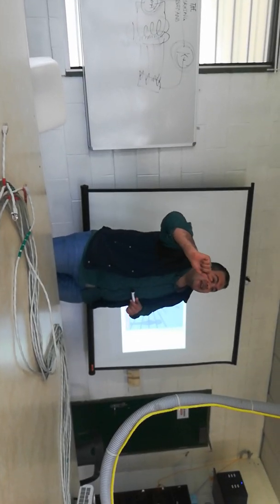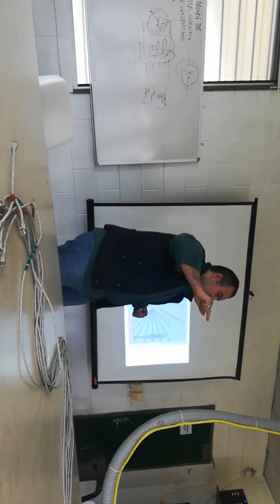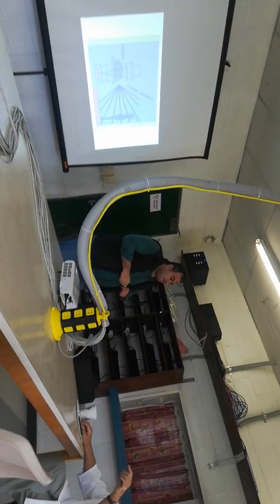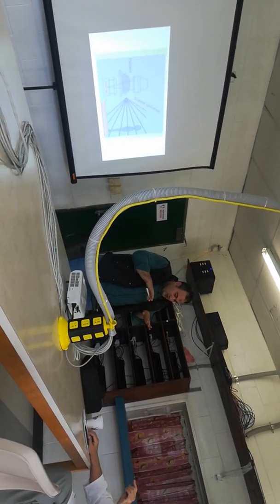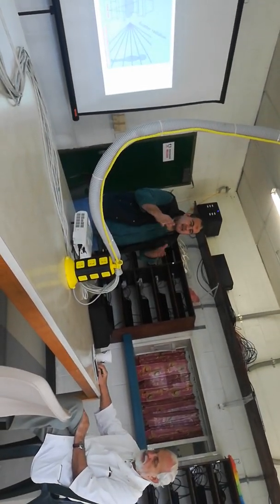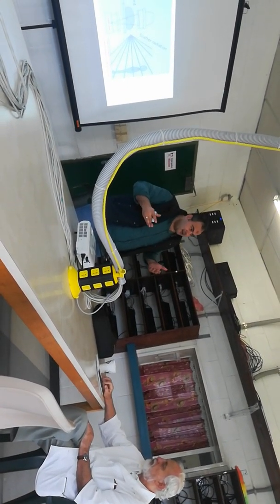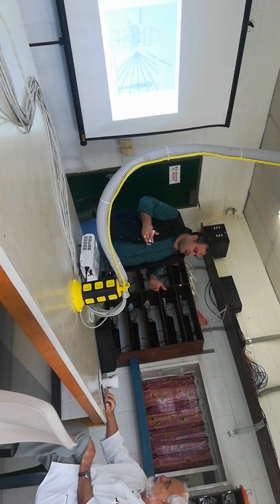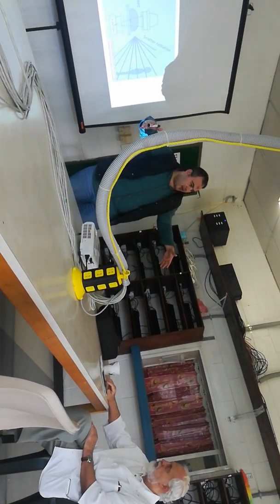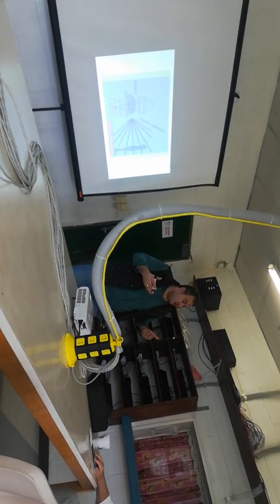But milliampere will increase the absorbed dose of the patient. So we should be rather reluctant to increase the milliamperes, as low as possible. You have to make an optimization. If the patient is thin, it is not necessary to increase milliampere. But if the patient is very fat, you have to increase milliampere or kV.